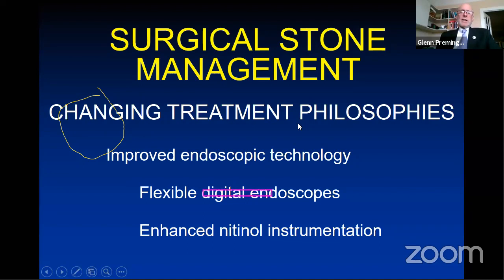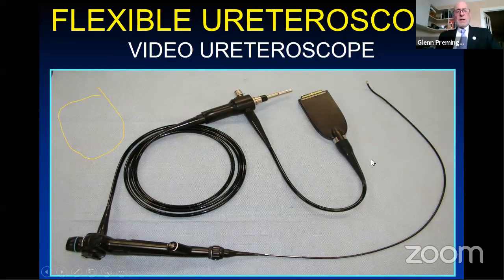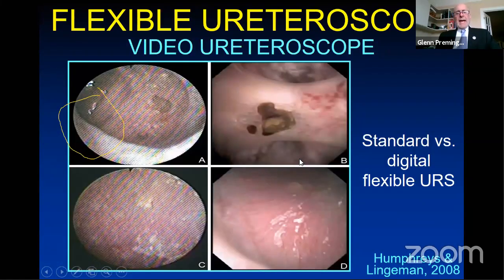So why has our treatment philosophy changed? Well, I believe it's due to improvements in endoscopic technology, specifically the introduction of digital endoscopes and enhanced nitinol instrumentation to help us remove these ureteral stones. I think all of you are familiar with the Olympus flexible ureteroscope. These became digital about 20 years ago, and it's well known now that digital imaging provides a superior optical image as compared to standard fiber optics.